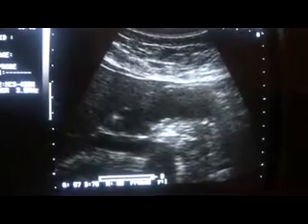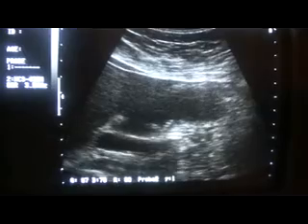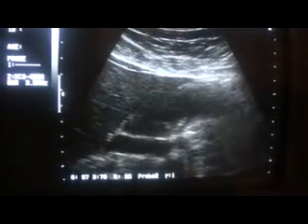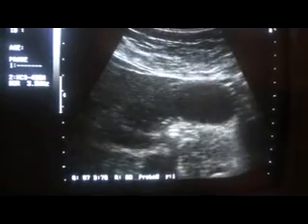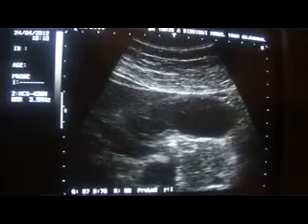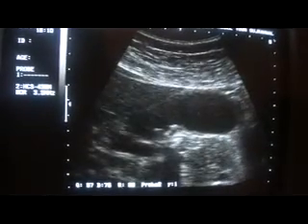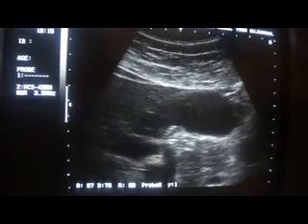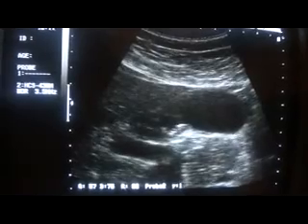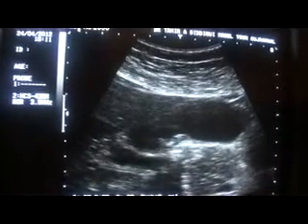So we have seen one thing. Now when you have gone through and picked a finding, don't stop, give another full view, as you may get some additional finding in case it is there. Now this is the transverse section of the gallbladder, and I can still see calculi in it. These are the calculi. This is the transverse section of the gallbladder.